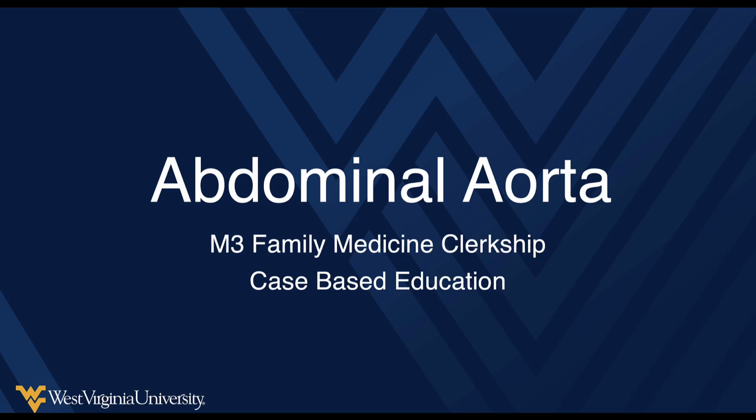Hello everyone, and welcome to this point-of-care ultrasound case-based discussion. Today we're covering the abdominal aorta, primarily targeted at the third-year family medicine clerkship. So let's jump right into the discussion.